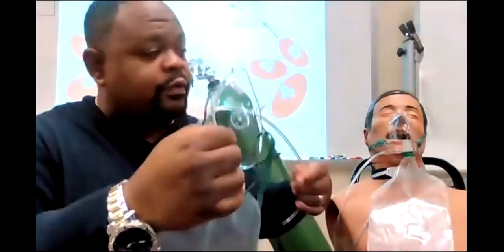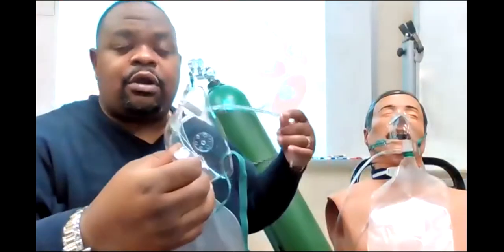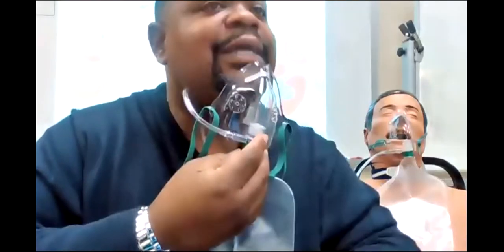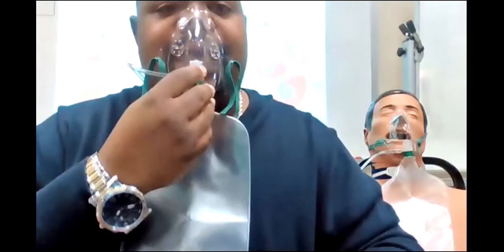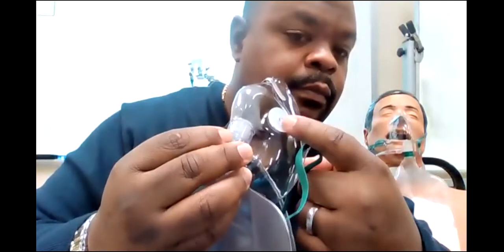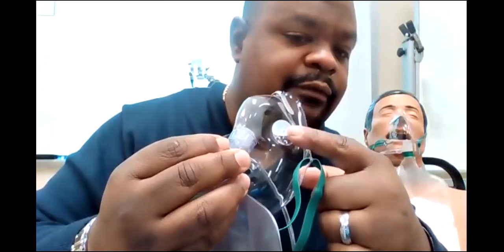So whatever I have this hooked to, whether it be oxygen, heliox, or carbogen, that's all he's going to get. Okay? Now, these side pieces here are considered to be exhalation ports. When I exhale, these little valves here are one-way valves. They stick on there just like that. See that? It's a little valve there. When I exhale, this valve will open up and let me exhale.